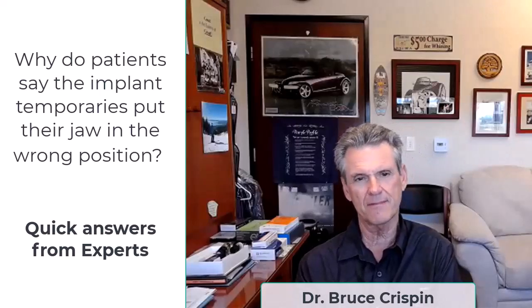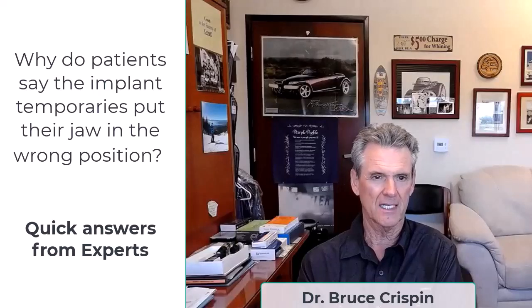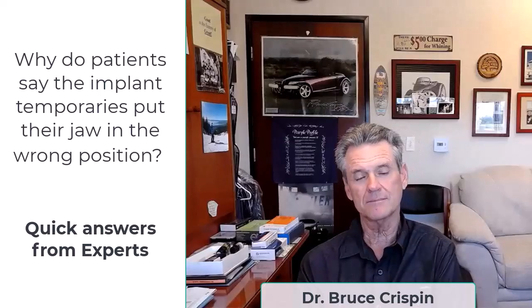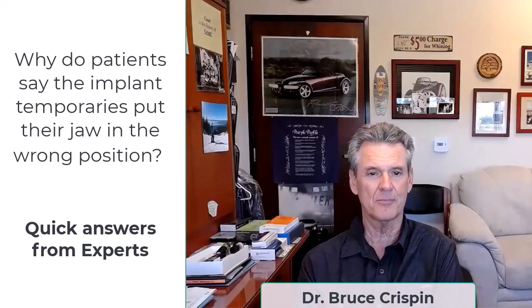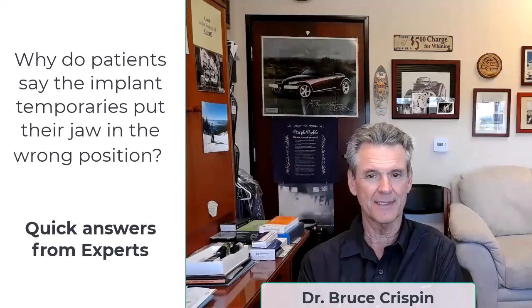Usually when patients complain about their bite being in the wrong position, they're a pretty good indication of what's right and what's wrong. And anytime you're dealing with entire arches, if you get the wrong interocclusal registration, or the lab builds things that aren't the way you want them, a lot of times maybe the bite is off. And some people can adapt to almost anything. Some patients are very keen on their bite, and I call it really having an acute occlusal awareness.